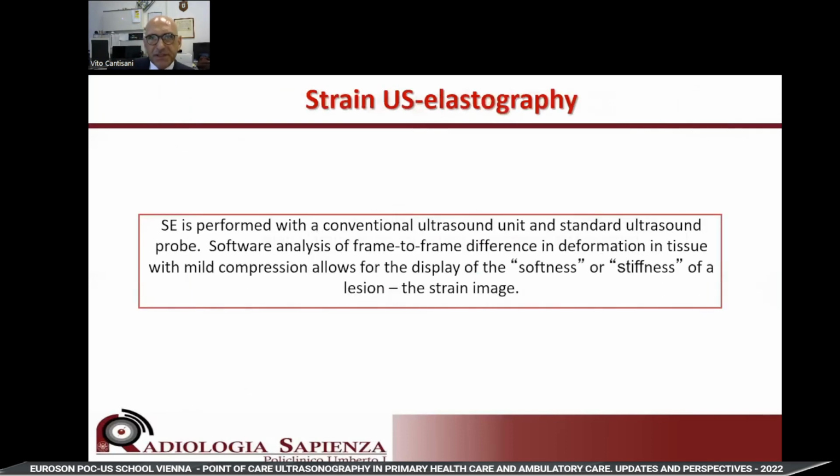And what is really important is that we perform elastography with a conventional ultrasound that is equipped with software analysis of the frame-to-frame difference in deformation of tissue, produced by compression or by dynamic excitation, in order to display how soft or how stiff it is.